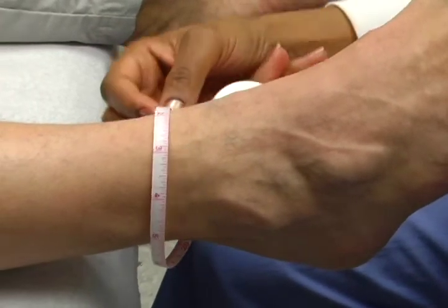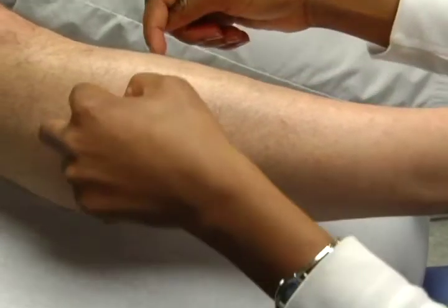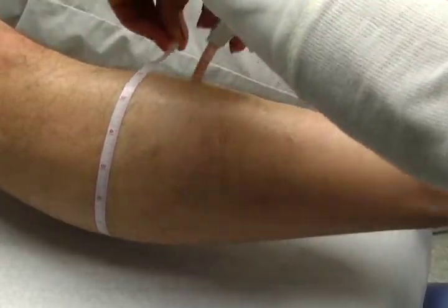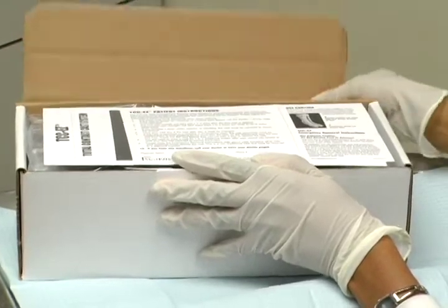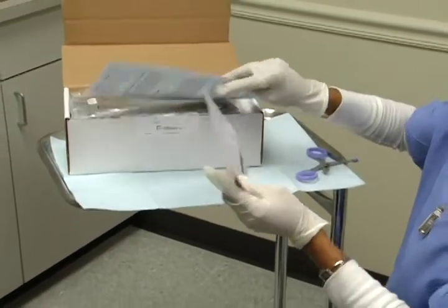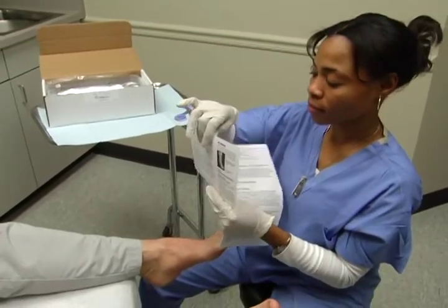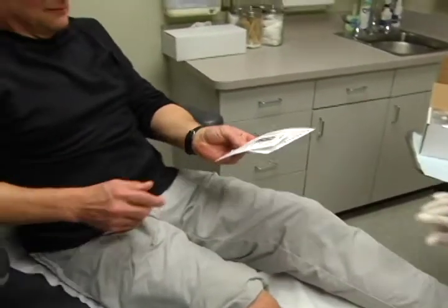The goal is to optimize the fit to lock the foot and leg in the cast to control motion. However, some foot deformities may not be accommodated in the TCC EZ. All of the components required for this total contact cast are included in the TCC EZ system. The primary dressing and patient information sheet are also included. Be sure to review the patient instructions and give them to the patient.